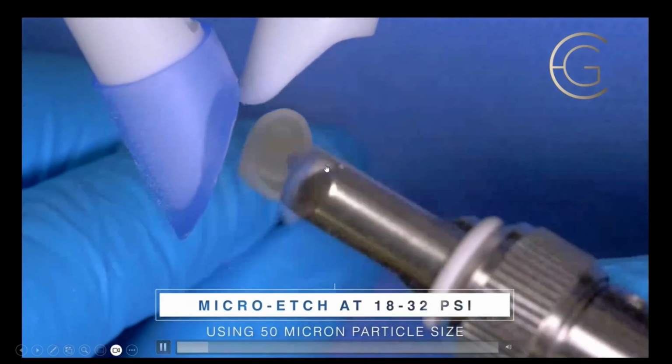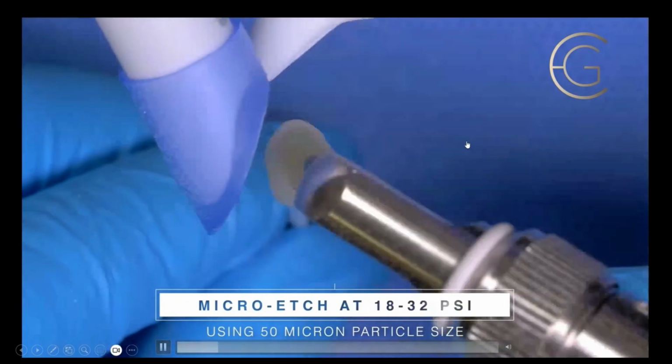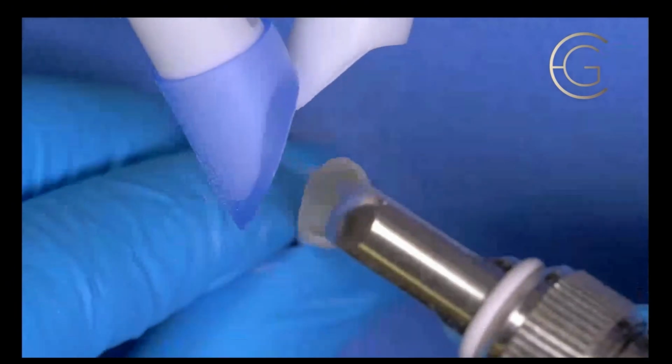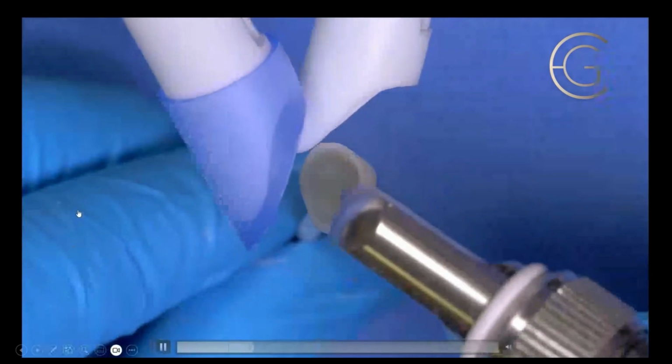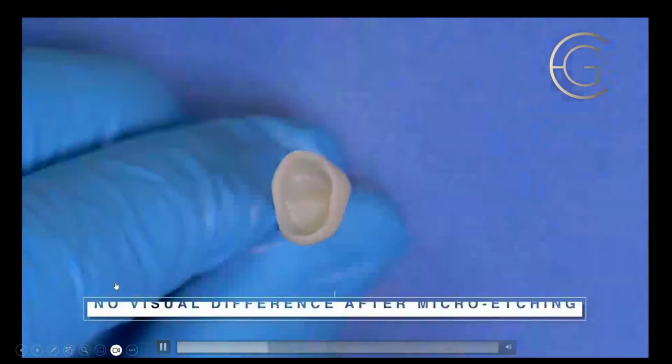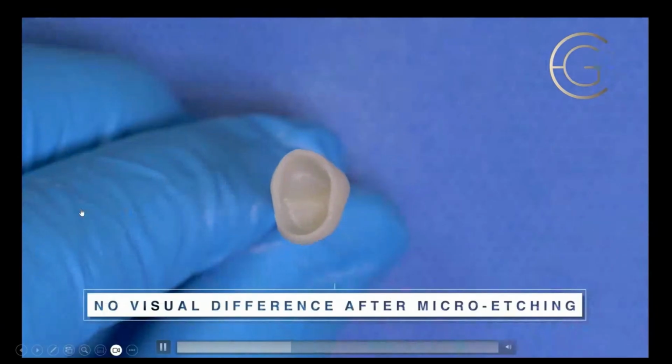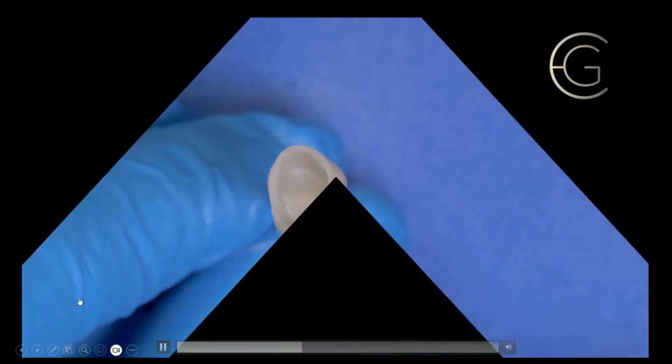All right, so now we're going to do this. I do a checkerboard pattern just an inch away, and yes, it makes a mess. So do this not in front of the patient. So I've tried it in, now I'm etching, I'm getting rid of a lot of the problems, okay? You still could have contaminants, but this is the best thing to do after you try it in on the patient's mouth, okay?